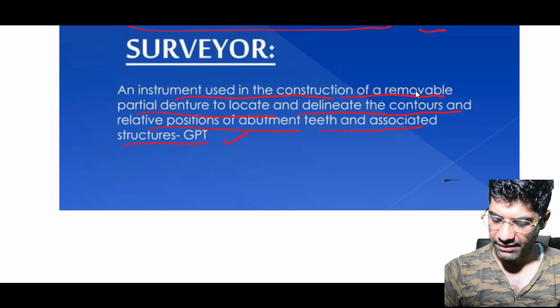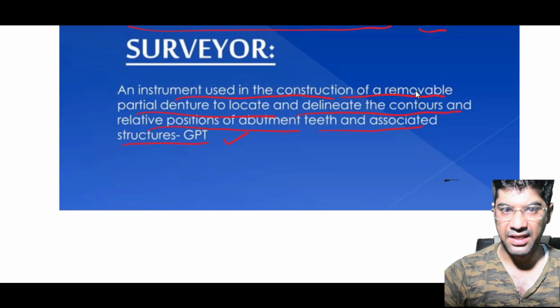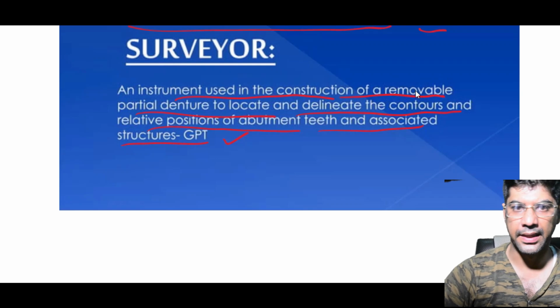So what is a surveyor? A surveyor is an instrument that is used in construction of removable partial denture to locate and delineate the contour and relative position of abutment teeth and associated structures. This definition is according to the GPT.